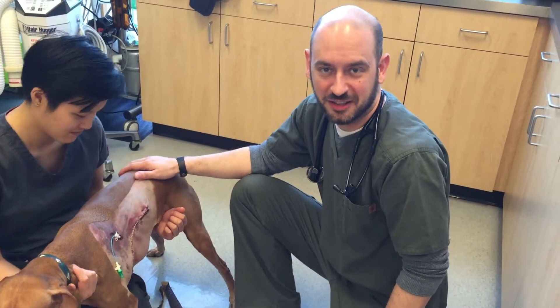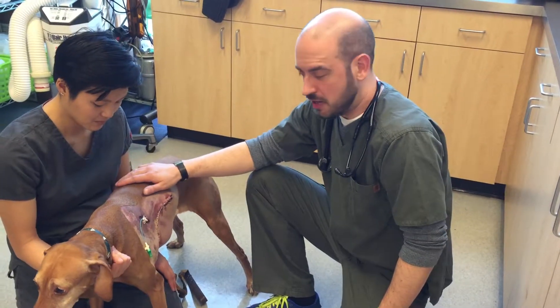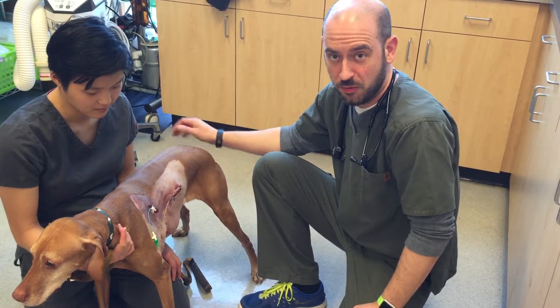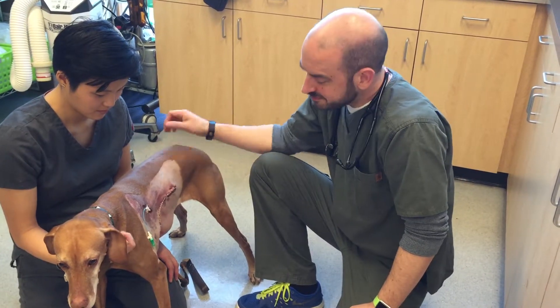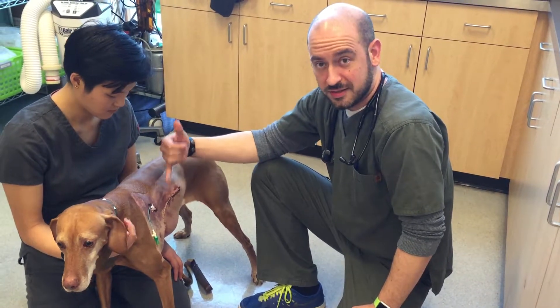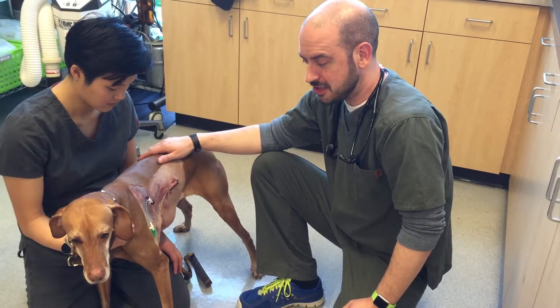Hi, this is Henry. We had something a little unusual that we don't see very often. This patient was here a few days ago for a mass removal that was right up against the chest wall. As part of our pain management protocol, we wanted to control her pain with as many different avenues as possible, so we inserted an infusion catheter right underneath the skin so that the owners can instill local anesthetics every six hours to give her some additional local anesthesia.